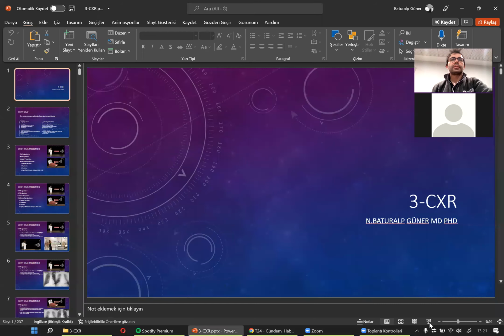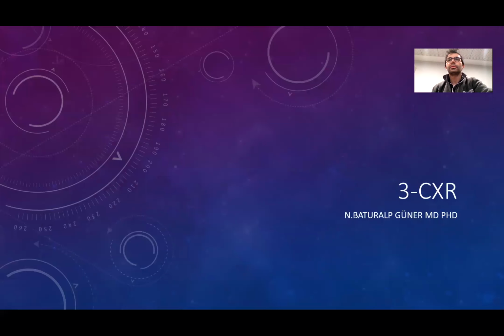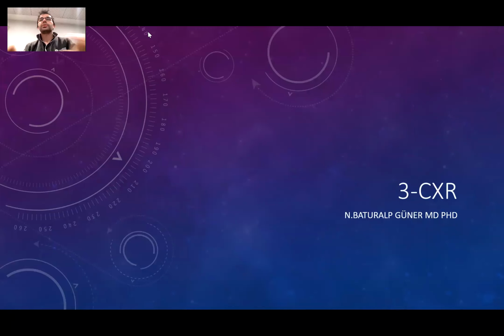So this is our chest X-ray. I have updated it with the most updated Turkish version. Now it's 230 something slides.